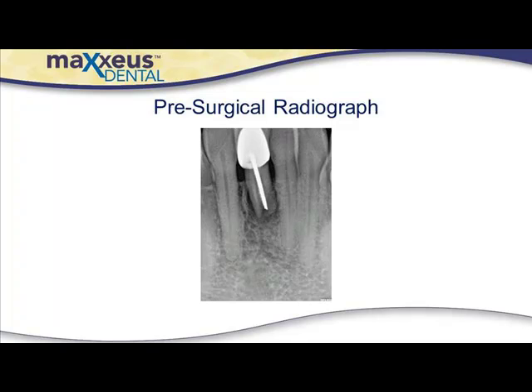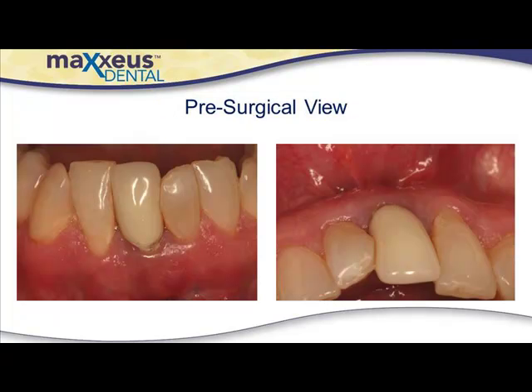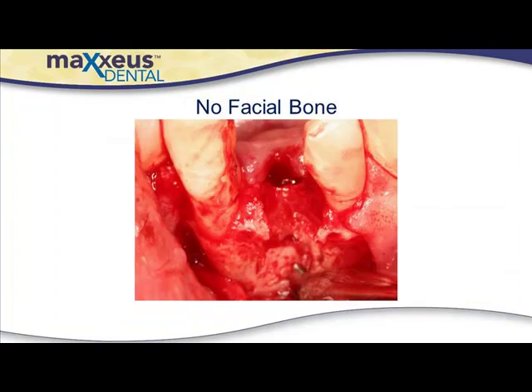This pre-surgical radiograph shows a hopeless mandibular incisor with external resorption. This tooth was planned for replacement with a dental implant. Clinical view of the hopeless mandibular central incisor. Note the erythematous gingival tissue and exudate below the crown.